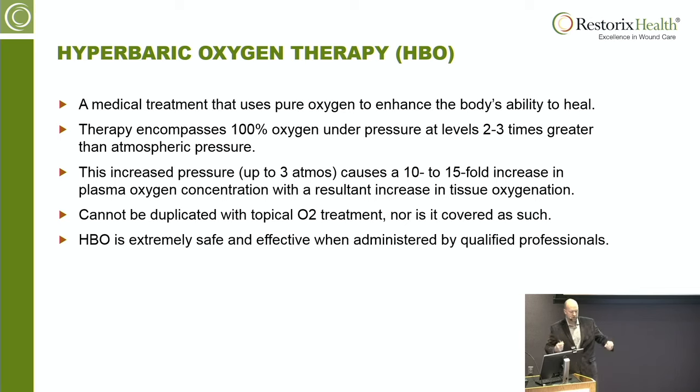So, you know, it stands to reason, okay, I've got a wound on my foot that needs to be treated. Can I just put my foot into a hyperbaric chamber? And that's what these little chambers they buy on eBay are designed to do. But we don't absorb the oxygen in hyperbarics through our skin. It's not absorbed topically. The oxygen is absorbed when we breathe pressurized gas under pressure. We supersaturate hematogenously. It happens in the lungs. It happens at the gas exchange level. So sticking my foot into a box that's pressurized isn't going to do anything.